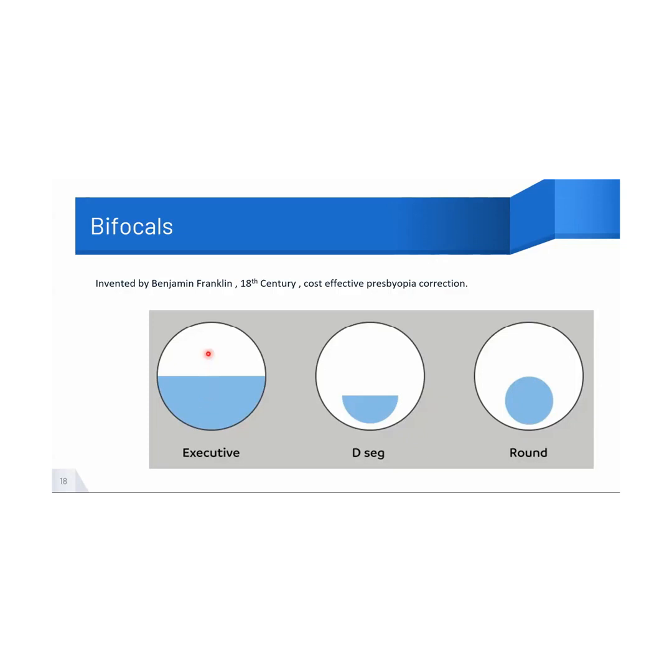It is going to be here. Now, for the eye, which is placed here at the optic center, to access the optic center of the executive bifocal is way far, right? So maybe when I'm trying to read, I'll be using the periphery here. And this is going to actually cause the image jump. Now imagine this is the distance that my eye is traveling from the center zone of distance to the center zone of near. Now this is your executive.